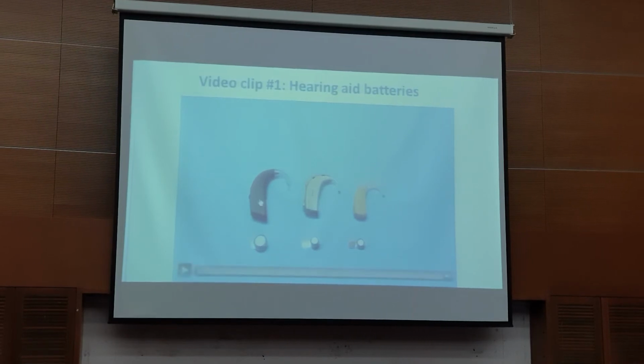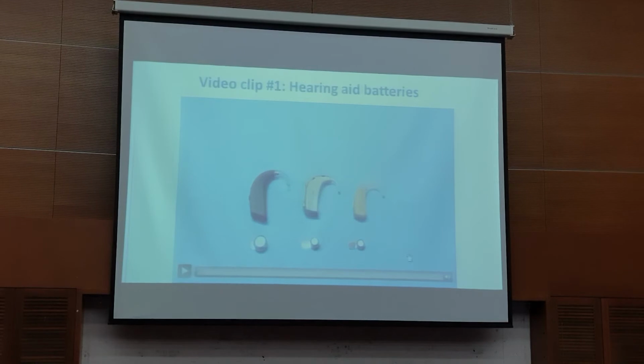If you can see these different hearing aids, they have different battery sizes. Kalau you tengok battery ni, dia macam battery jam, but they are not. And so if you see your patients, jangan suruh dia pergi kedai biasa-biasa beli hearing aid battery. Dia mesti dekat hearing aid centers, right? Because even though they look the same, they are not the same. These are batteries just for these hearing aids, the different types.